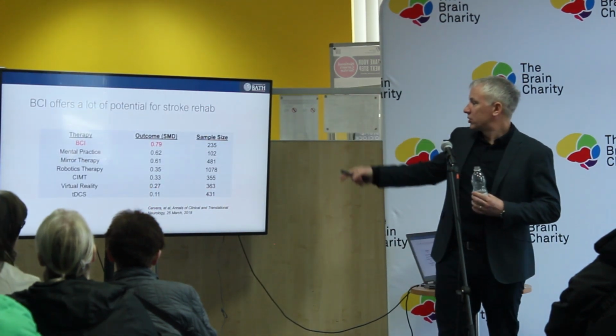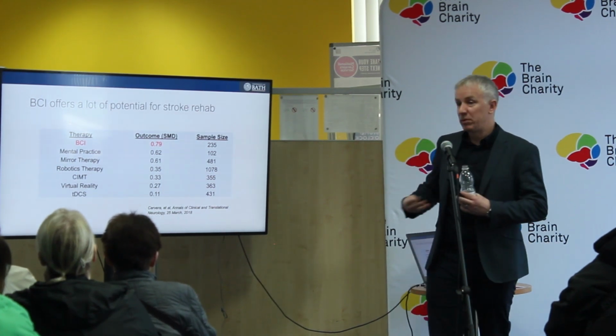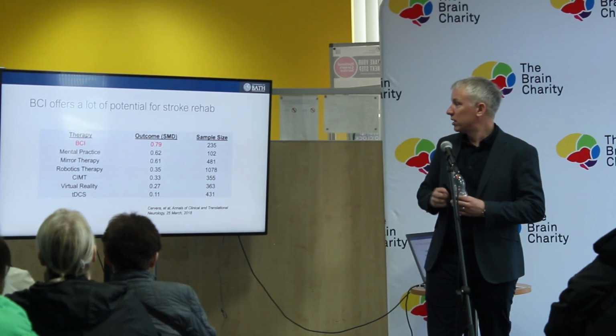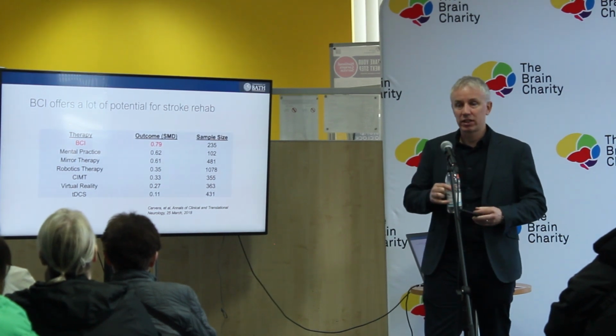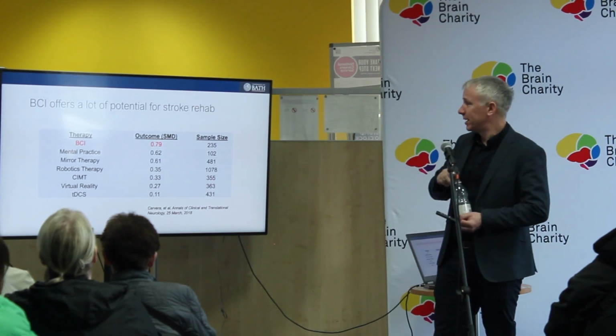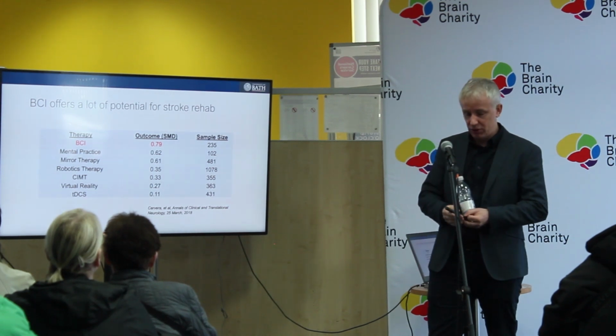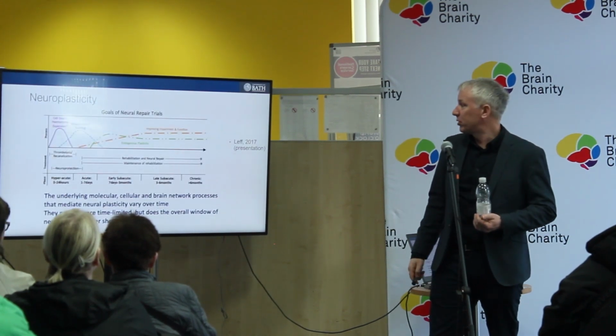So this is a study done a few years ago showing the outcomes for different feedback therapies and different technologies, and it's shown that brain-computer interfaces actually provide the most benefit, simply because it's very active. You have to engage the brain first, so that's another benefit of brain-computer interfaces.